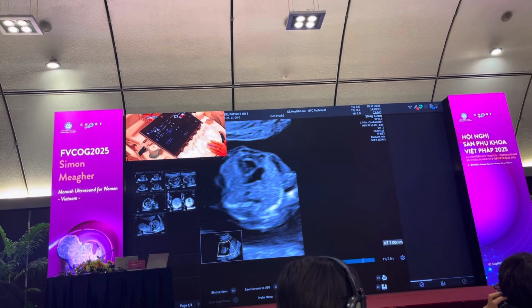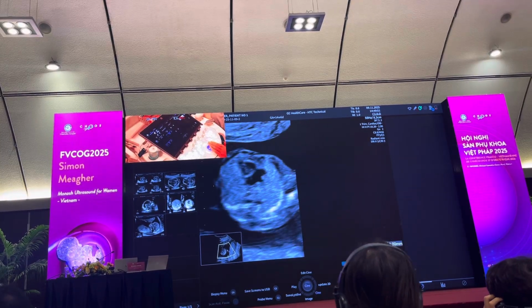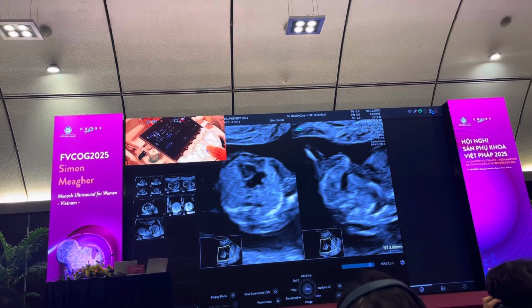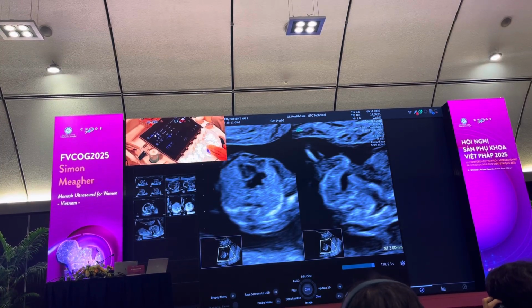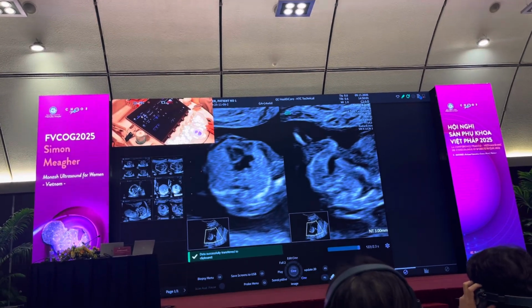And I see the right atrioventricular valve, but the left ventricle is smaller when compared to the right. And then I do a sweep up to the 3 vessels view, and I only see 1 vessel coming out. And I need to look at the curvature of that vessel coming out of the ventricle. Once I've got that, I save that cine loop to screen.